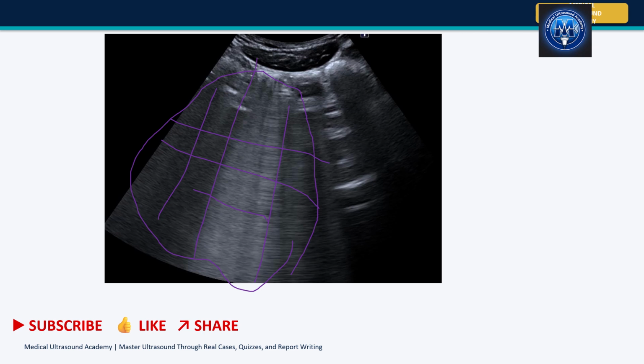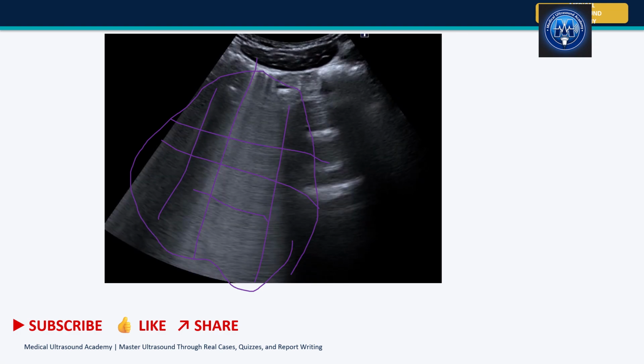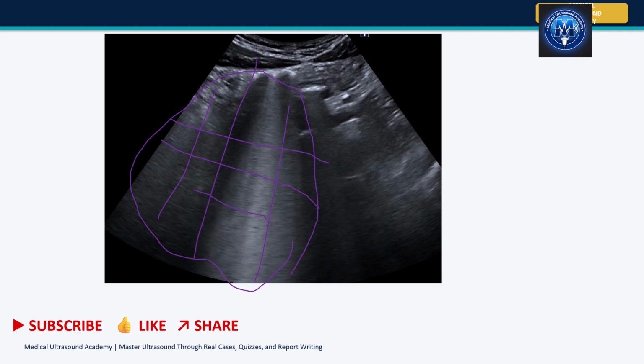But not all gas is caused by that. If someone is bloated, the gas can still accumulate. Like in this case, the patient is fasted enough, but you can still see that there's bowel gas that is recurring like that. So it still remains a challenge to visualize the other structures when there's gas. Those are some of the limitations of ultrasound itself, because when there's gas, you can't really make much out of the anatomy. It is obscured.